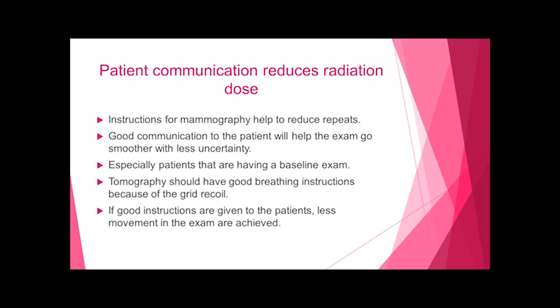For the mammogram, you have to give good communication to the patient to make sure they understand what's going to happen with the test. Especially for patients having a baseline mammogram, you really want to explain that the compression paddle is going to come down and put pressure on your breast. Don't let that scare you. This is normal. You're going to hear noise. That's the radiation sound going off. And in tomography, you should have good breathing instructions also because of the grid recoil.